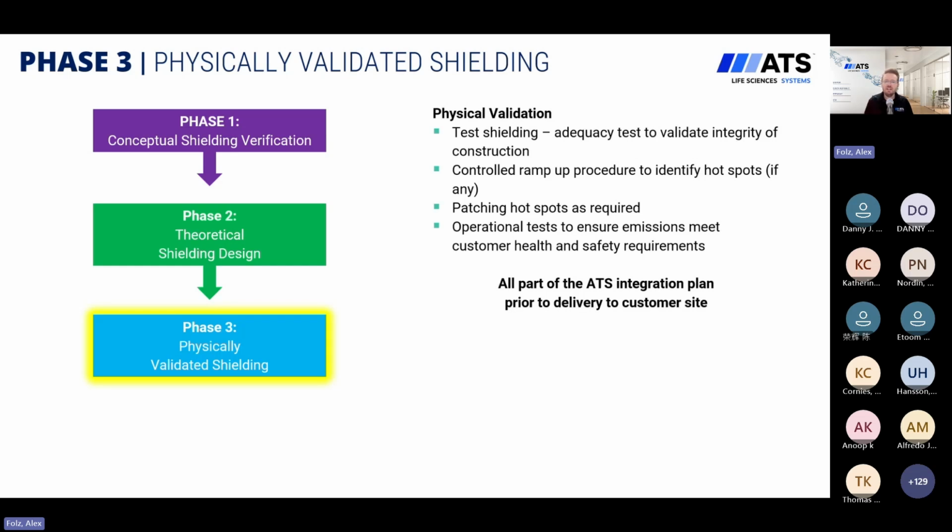Ideally this is not an iterative process. We're ideally not finding any of those hotspots, but at the end, we're going through this full operational test at full energy, making sure that we've met all emission requirements outside of the equipment. And this is a part of every machine prior to install or delivery to any customer site.